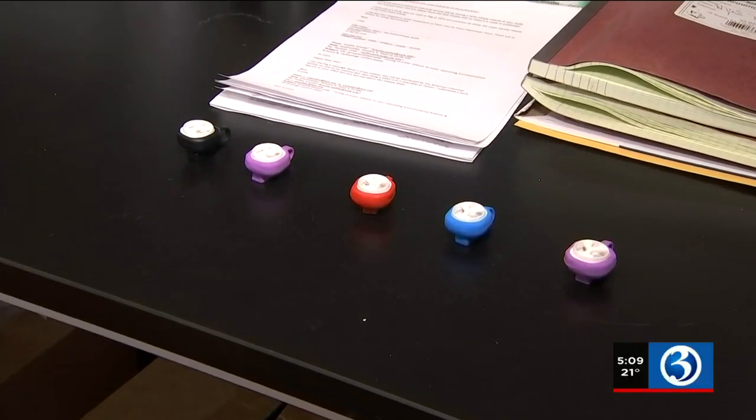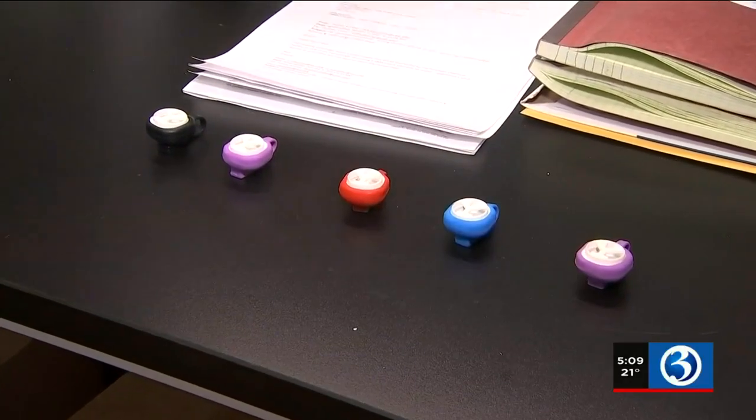While the device returned positive readings, this does not mean the person wearing it was positive. We will just tell you you should quarantine or get tested because you did have an exposure event.